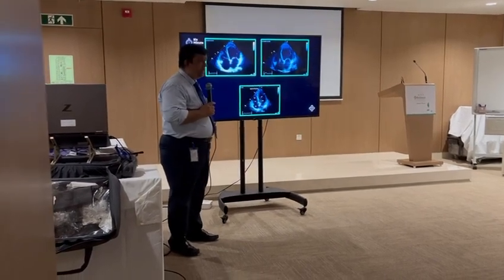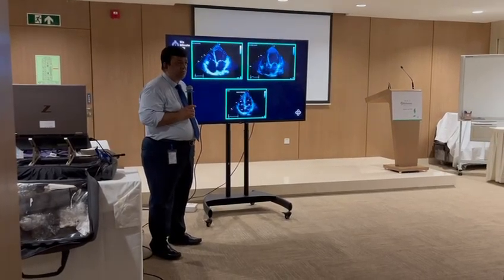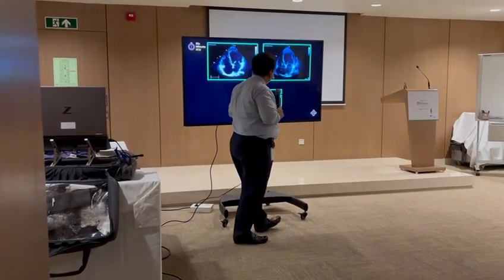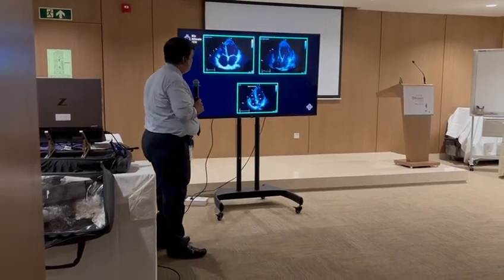What else can you see there abnormal? There's so much there. You've not mentioned yet. Effusion. Pericardial effusion is seen. Okay, so you can see that the pericardial effusion is there. Okay. What about the right ventricle? Nobody wants to comment on the right ventricle.